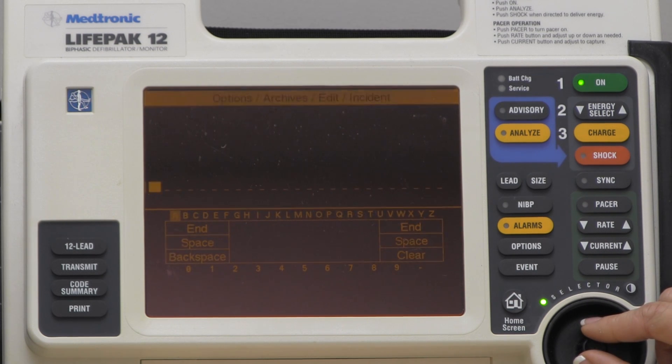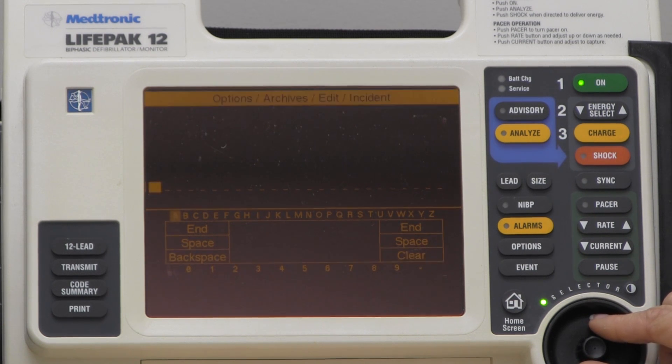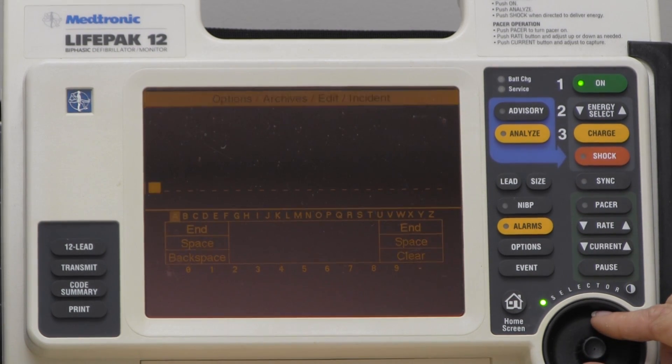So that ends how to place a patient's name into the cardiac monitor once it has been turned off.